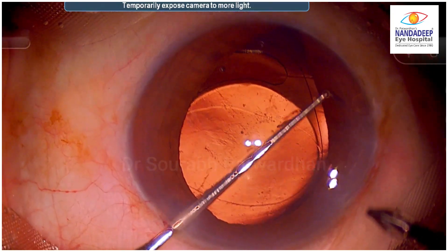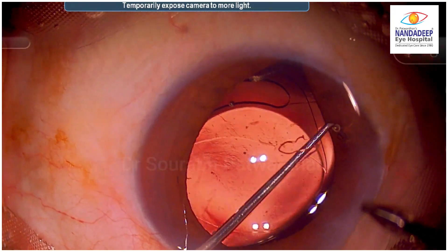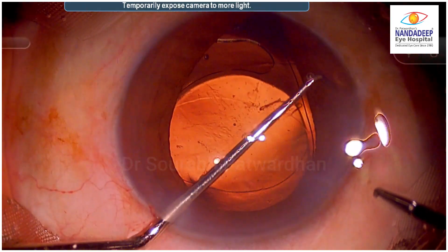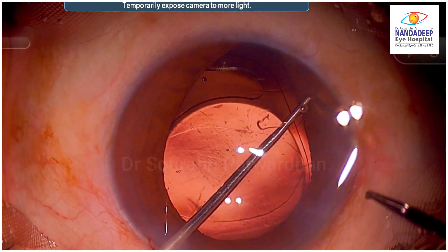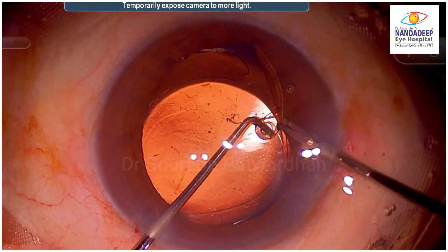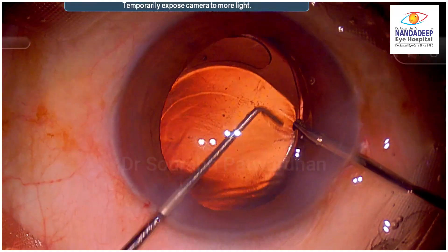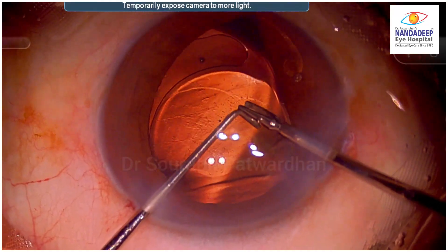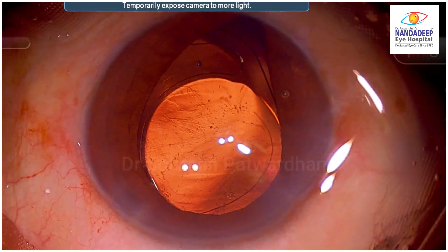Here the surgeon tries to retrieve it and hold the eyelet, but then decides to call a senior surgeon. The surgeon is trying to pull it out and almost succeeds, but then attempts directly putting it into the bag, which is not going to be possible.